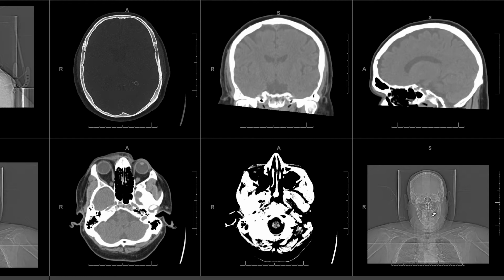Your background lighting should be similar to the brightness coming from your screen. Make sure you don't have any glare. You want to be as far from the screen as possible and still see the image and reach your mouse.